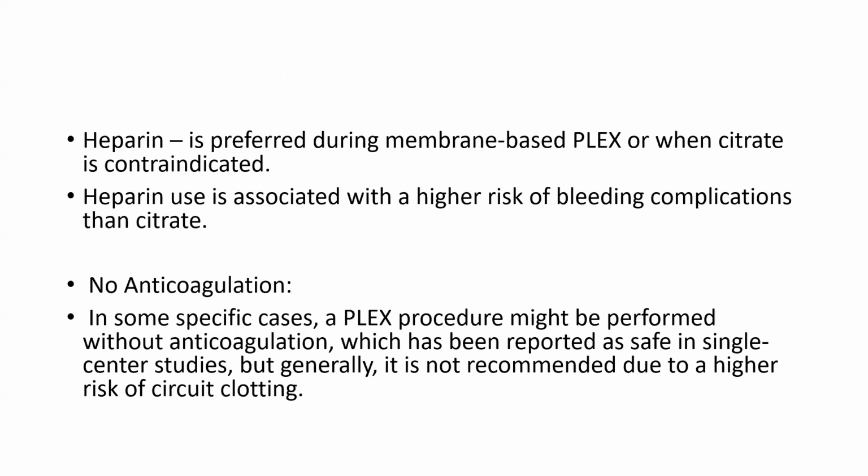Heparin is preferred during membrane-based plex or when citrate is contraindicated. Heparin use is associated with higher risk of bleeding complication than citrate. Sometimes we are not using any anticoagulation, in some specific cases where the plex procedure might be performed without anticoagulation, which has been reported as safe in a single center study. Sometimes there is a high risk of bleeding, or sometimes there are conditions when we cannot use citrate as well as heparin. So we can proceed ahead with a no anticoagulation strategy.